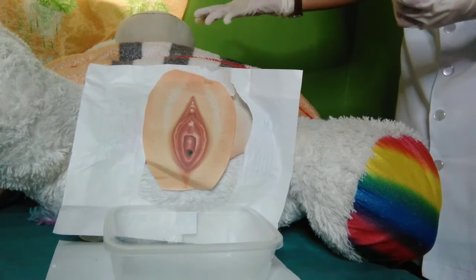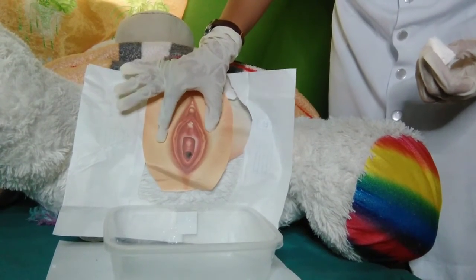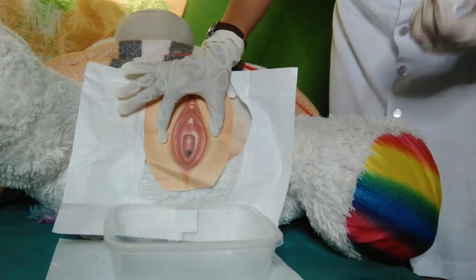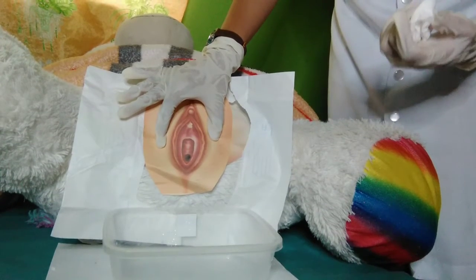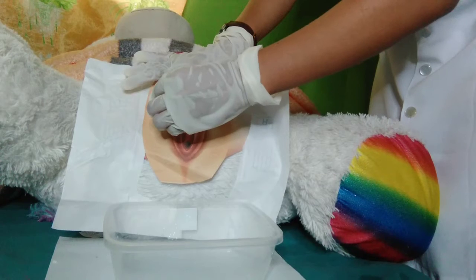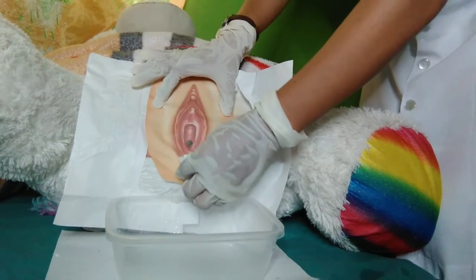So my patient is a female, so separate the labia with the fingers of the non-dominant hand, now contaminated and no longer sterile. Using the sterile technique and the dominant hand, clean the labia and urethral meatus from the clitoris to the anus, and from the outside labia to the inner labia folds and urethral meatus.